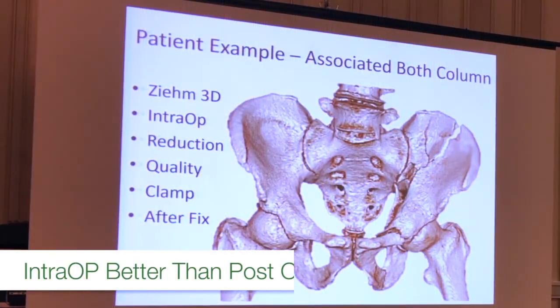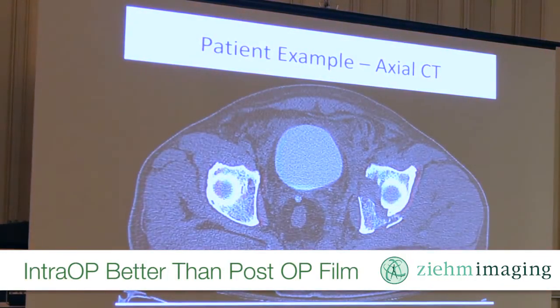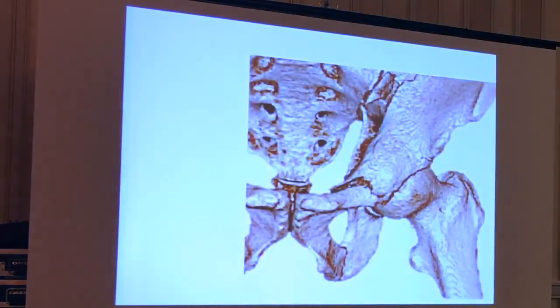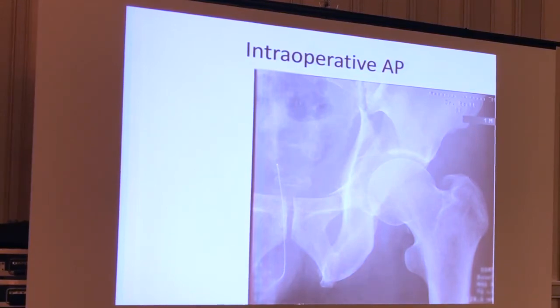This is a patient from about two months ago who's got a nice, clean fracture — that's why I chose him to show you. He's got a nice, chunky component to his fracture. This is his pre-op CT scan, and this is his CT 3D surface rendered. This is his intraoperative image — this is just him in the operating room, supine on the bed, before we start, to make sure that nothing's changed. You can ghost him in if you'd like to help with that.